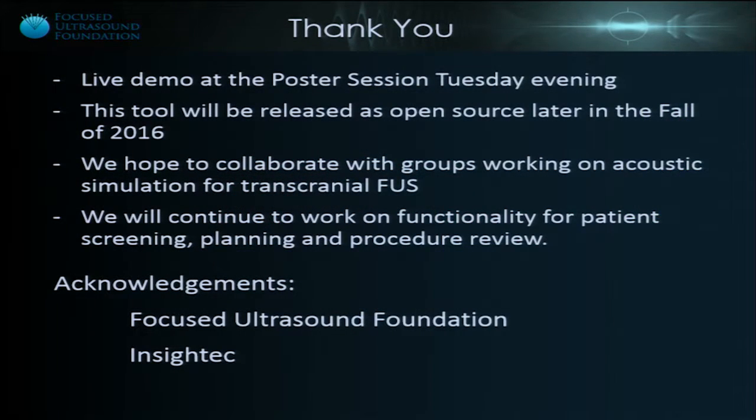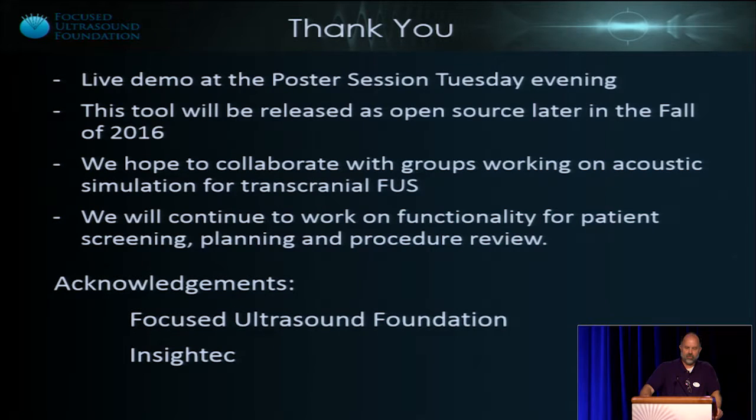We'll have a live demo of this at the poster session for those of you who have interest and have questions about it. We intend to release this in some kind of usable form into the wild as open source this fall and use it as a tool for collaborating with acoustic simulation groups. And hopefully as we go along, it will grow up into something that might have some clinical utility. Thanks a lot.